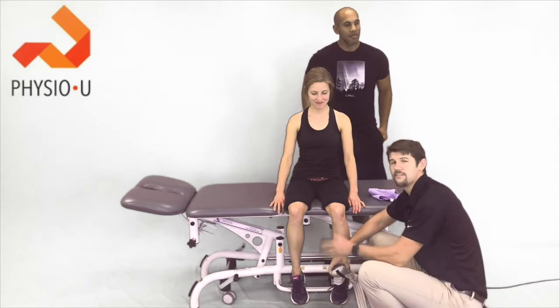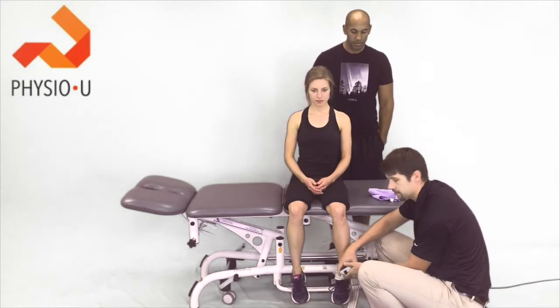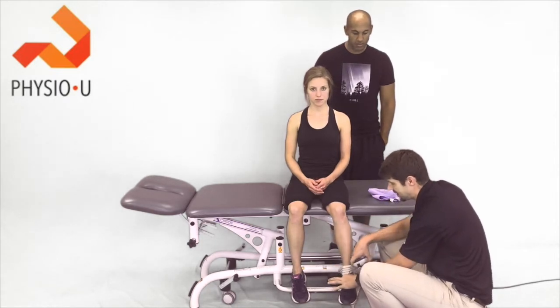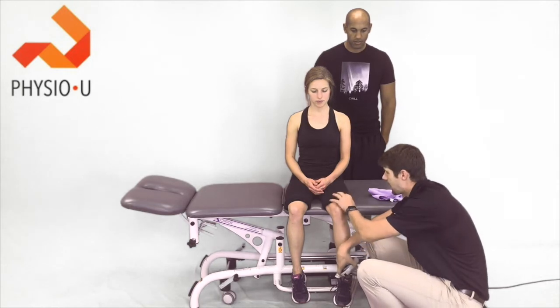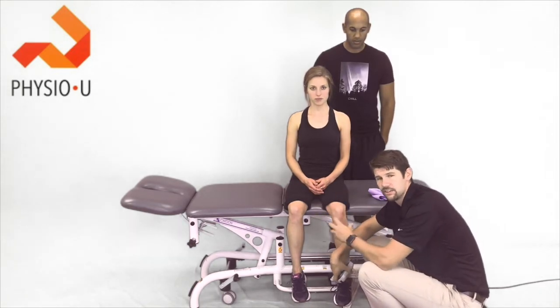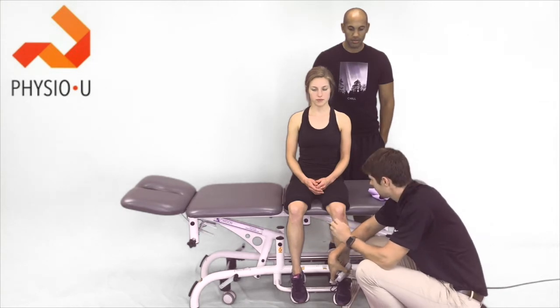What the study found is that the handheld electronic dynamometer as well as the knee extension from 90 to 45 degrees — those two had fair outcomes compared to the gold standard. So they are good ways to use in the clinic.